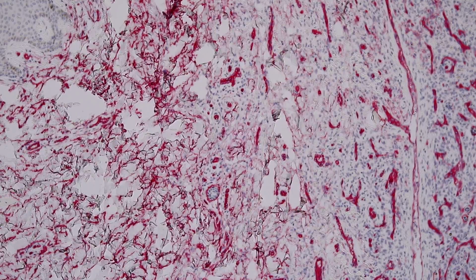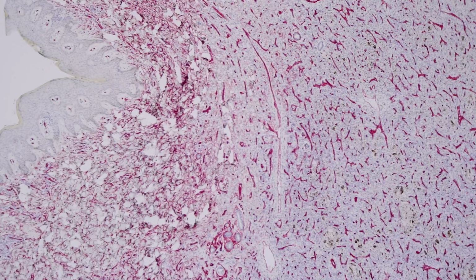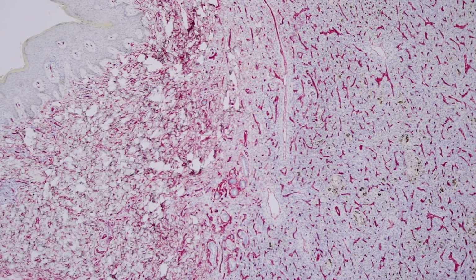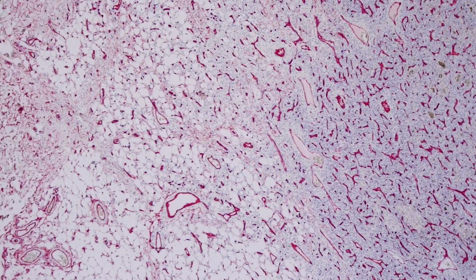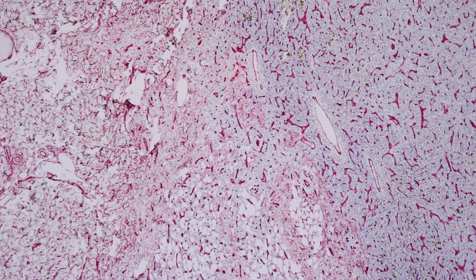And oftentimes, as the dermis comes up to the periphery of the tumor, like you can see here, those dendritic cells tend to pile up and cluster at the edge of the tumor, and so you'll see this kind of halo of bright staining. Not very dramatic in this case, but in some cases it can be really bright staining around the edges and even into the lesion itself of dermatofibromas.